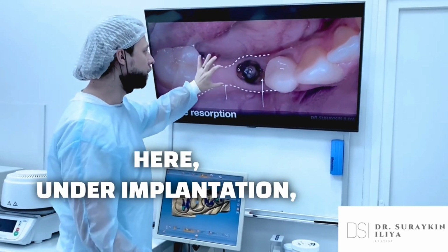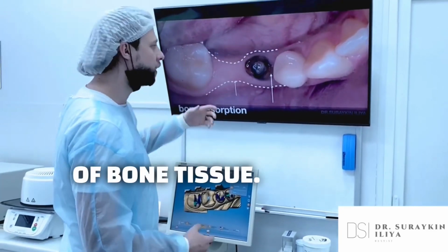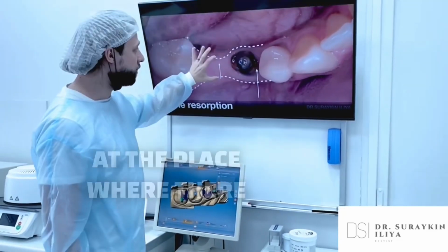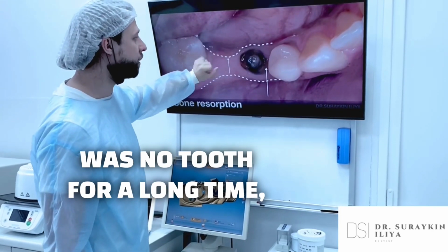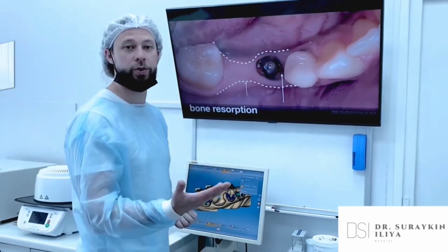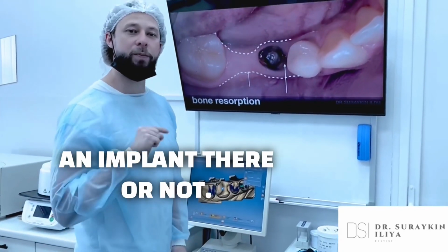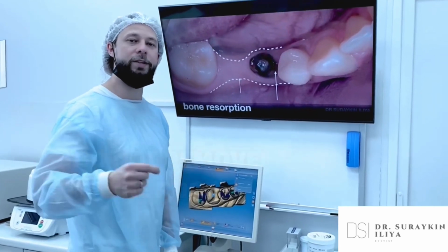Here, under implantation, you need to take either a smaller diameter or perform augmentation of bone tissue, and soft tissue, of course. What I showed, at the place where there was no tooth for a long time, the bone has gone. And at the place where the root is present, the bone is in stock. When the doctor tells you to remove the root, first think about whether you will put an implant there or not. If you plan to put an implant, do not remove the root.